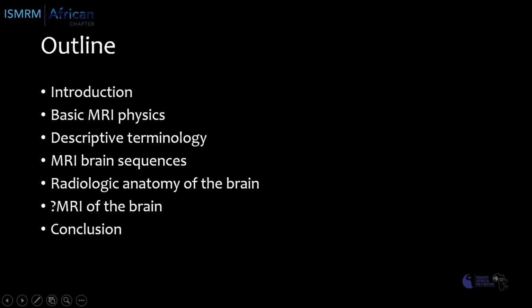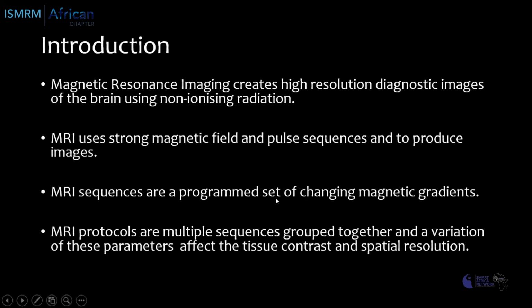Then we'll conclude the presentation. By way of introduction, MRI creates high resolution diagnostic images of the brain using non-ionizing radiation.